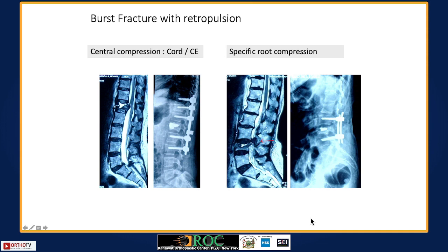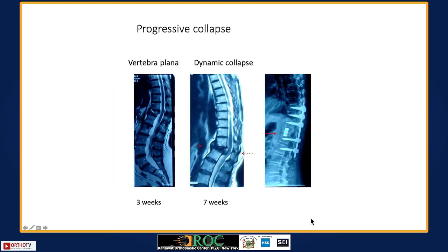This is a typical example of an osteoporotic fracture with a burst retropulsion, and this was stabilized posteriorly with a vertebroplasty filling up the anterior defect. Now one has to understand that the vertebroplasty is more of pain control rather than stability. So even if you have such a solid construct, that construct may tend to pull out over a period of time because of gradual movement. So the osteoporotic fracture has to heal, and that's where the whole debate comes into picture.